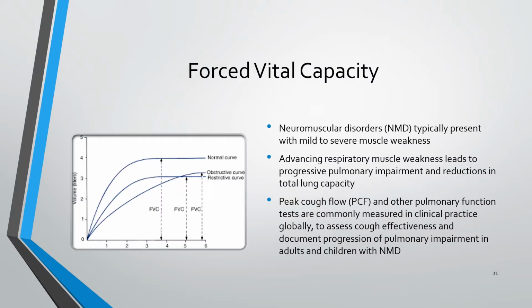Among the various types of spirometry tests done on patients with neuromuscular disease, the forced vital capacity or the slow vital capacity allows assessing the extent and the following of decline over time of restrictive patterns known with these neuromuscular diseases.